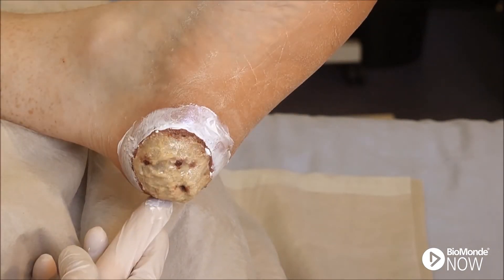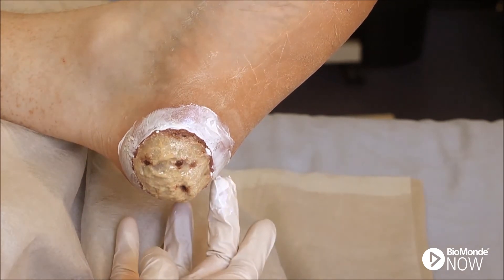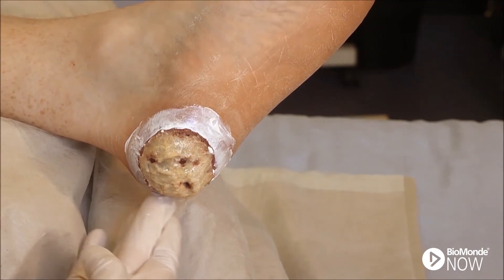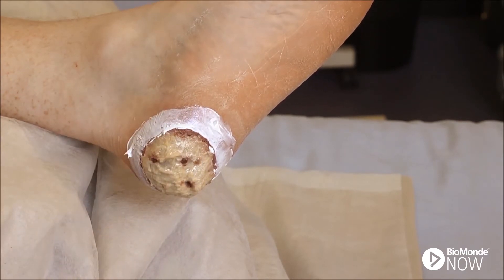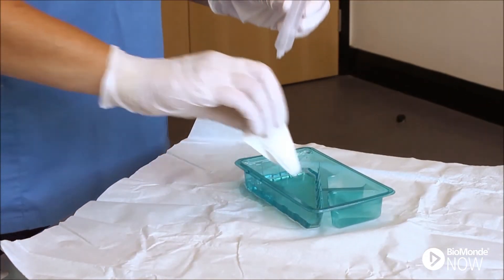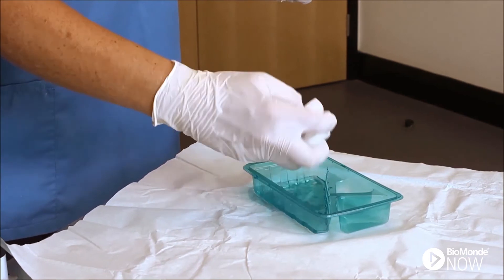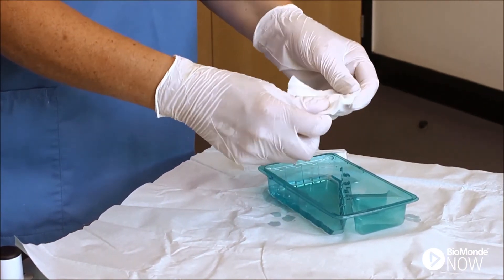Protect the peri-wound area using a barrier or zinc cream. This barrier may need to be reapplied daily. Moisten some gauze in saline solution ready to place directly on top of the larvae. Wring the gauze thoroughly — it should be moist, not wet.